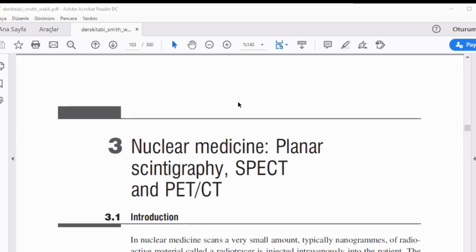Okay, this is your textbook. Chapter 3 is related to our weekly material for today. It's about nuclear medicine, an aspect of medical imaging techniques, and 3 different modalities are being taught in the chapter. So-called planar scintigraphy. Scintigraphy is the usual clinical name for nuclear imaging technique. Single photon emission tomography, so it's a nuclear imaging computed tomography technique, so slice imaging, and a modality which combines positron emission tomography and CT together.